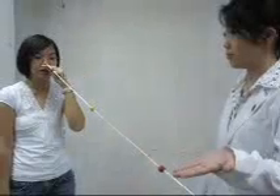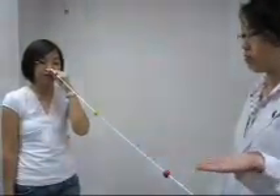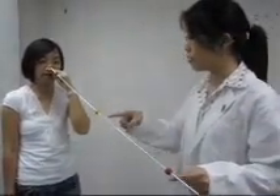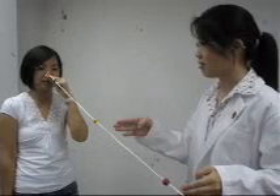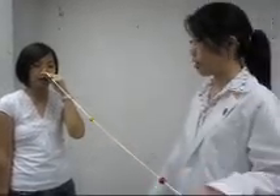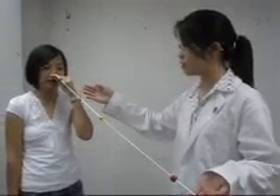Please look at the red bead. How many beads do you see? Two yellow beads. Still focusing at the red bead, how many green beads do you see? I can see two green beads.